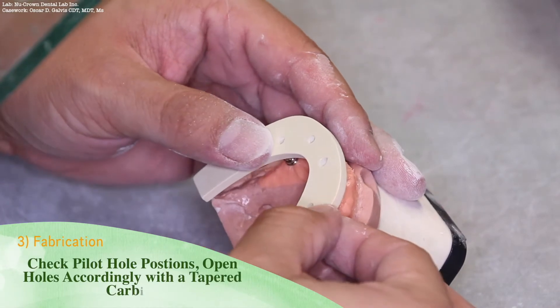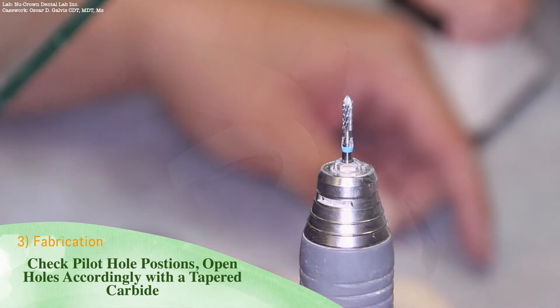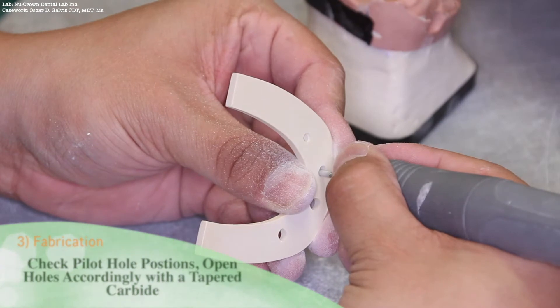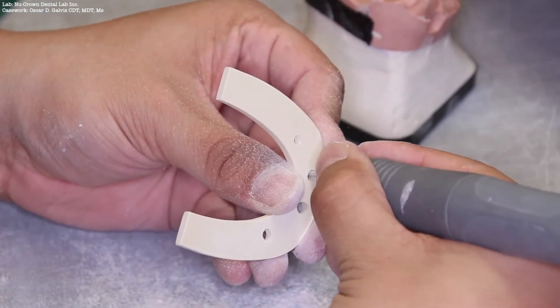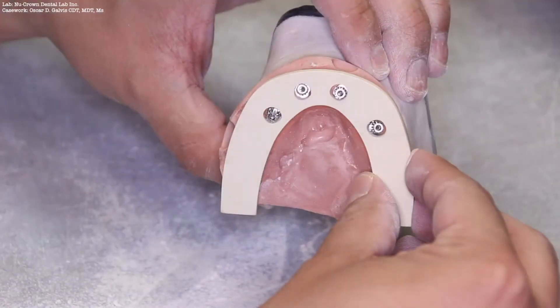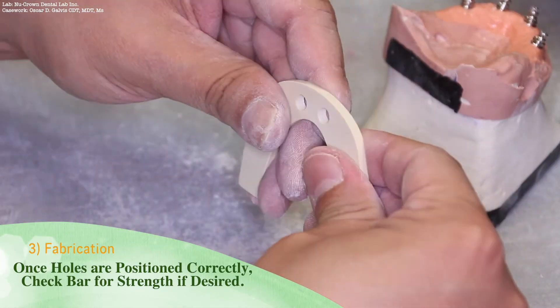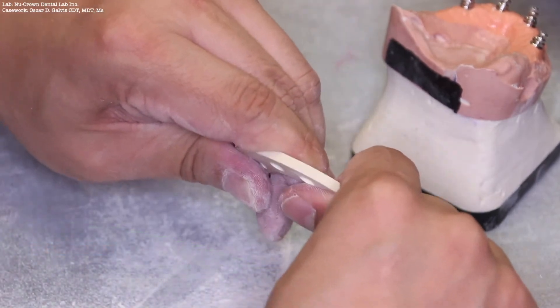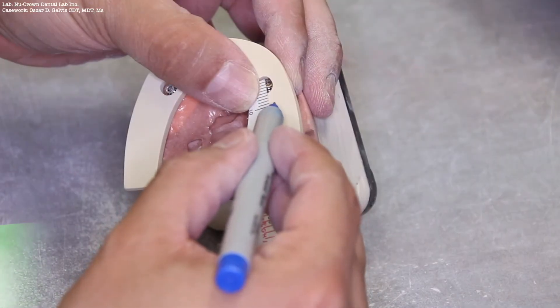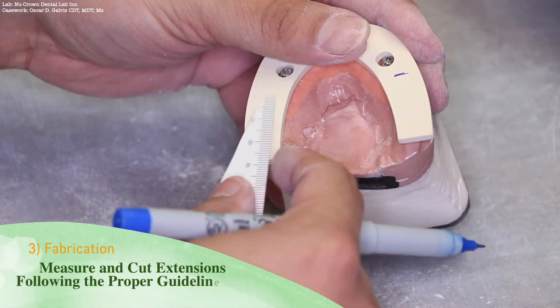Check the pilot hole positions and open those holes accordingly with a tapered carbide burr. Once the holes are positioned correctly, even checking the bar for strength, the Trilor still holds up. Following AP spread guidelines, measure and cut any extensions.